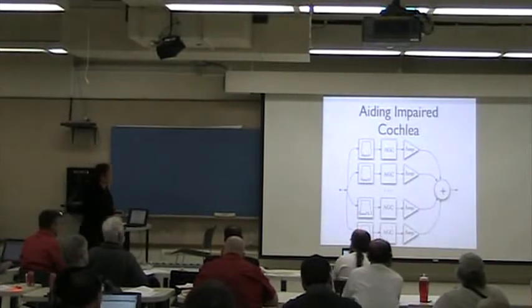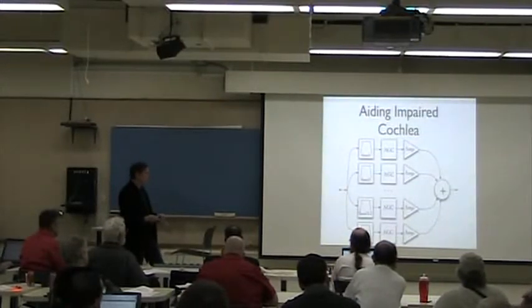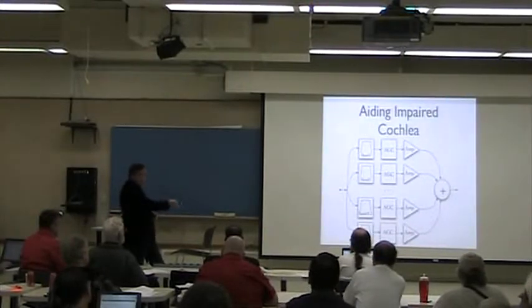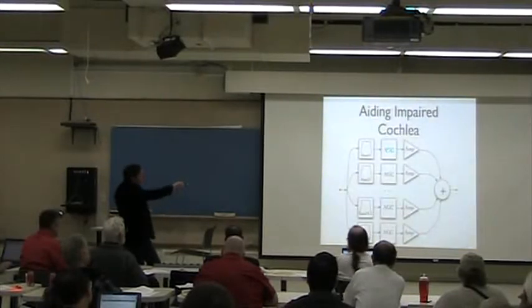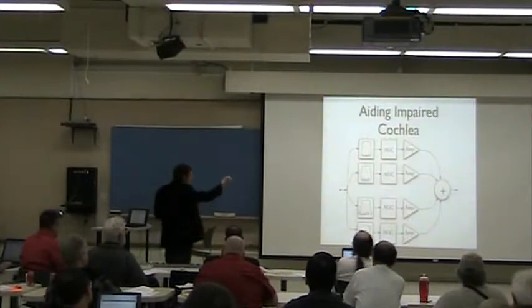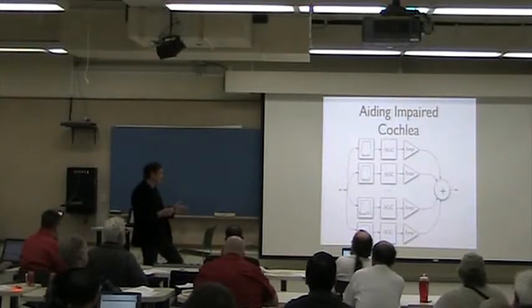So you have to design the mechanical or analog or digital device which basically has multiple frequency bands, multiple automatic gain control devices which are compressors, and multiple amplifiers which control separately the gain for every band.